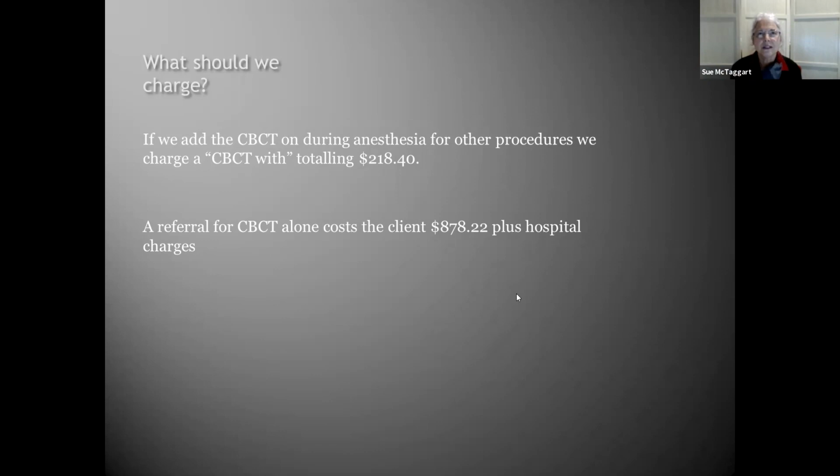If I've done a root canal or vital pulpotomy and they come back 6 months later, we heavily sedate them. At the moment, I'm using 2D for that, but if I take a 2-dimensional radiograph and I can't see exactly, or it doesn't look great, then I might do the cone beam to give me more information.